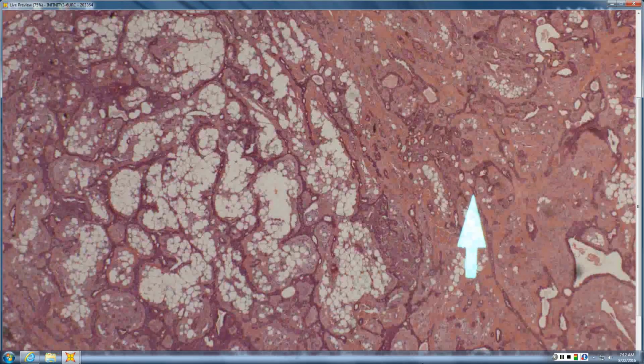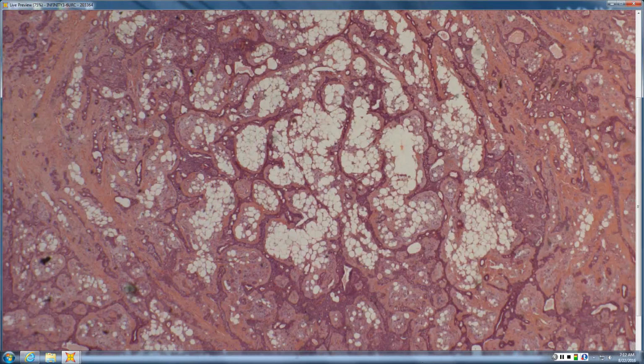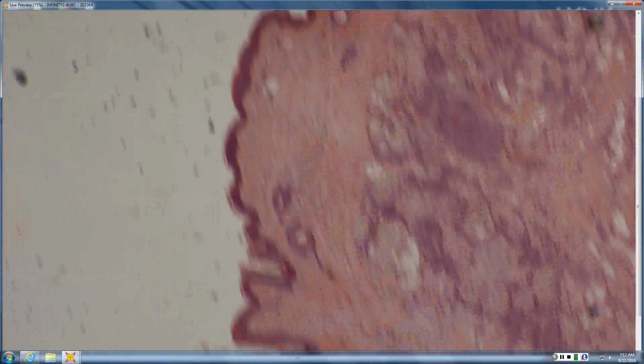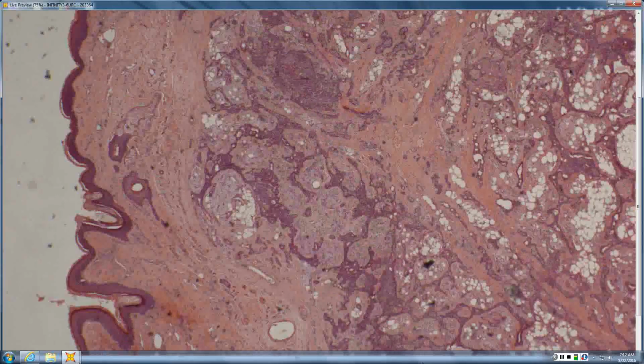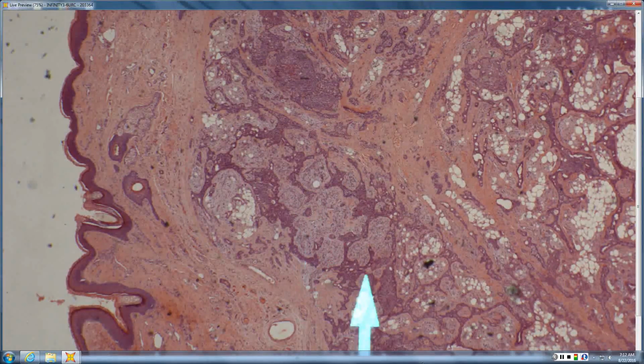This one is just another mixed tumor, and this is more the branching alveolar type. The reason why this is a good comparison is because you still get a dermal proliferation, you see skin up there, and you still get this bluish appearance in some areas. And so you say, oh, that almost looks like mixed tumor, and you got this really deep blue, branching alveolar syringomatous pattern with ducts within.